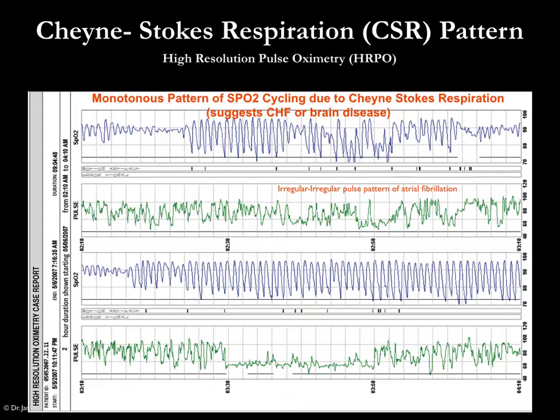When your thermostat works, instead of keeping it at a nice 72 where it might go up to 73 and down to 71, overnight it just stays in that little tight range. But if that same thermostat started going up to 80 and down to 60, now the average is 72, but it was very high and very low. That's really what the body does with Cheyne-Stokes, and that's what you're seeing here.